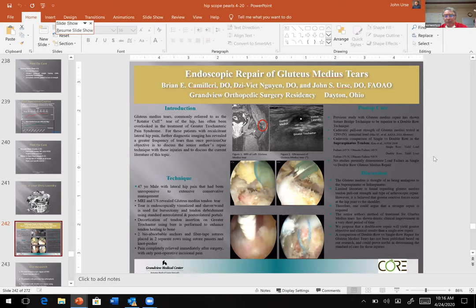They were a bursa removal. I was taking their bursa out through a scope. I saw this hole and thought, I ought to fix that. It looks like a rotator cuff tear. I thought, if I was going to fix that, how would I fix a shoulder? I'd probably put an anchor in, grab the tendon, and just put it back. Why don't I do that?